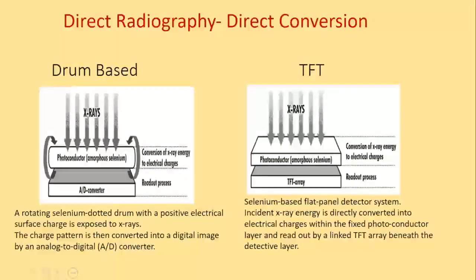With digital direct radiography, that is a direct conversion, what we are all talking about today, CBCT, please note they're all flat panel detectors, and these are all made of a material called selenium. And why selenium? Selenium by itself has a very inherent property of having good spatial resolution.